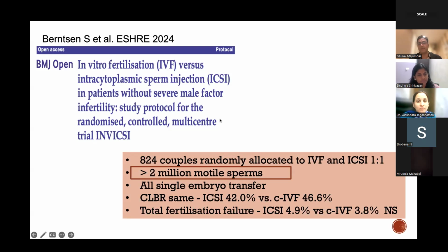And this is for short incubation IVF, sir, or is this... That depends, that's a good question. See, actually the number of sperm that we are adding is not too much, so you can do a long insemination. That's why I wanted to know, because when they add high numbers, they usually prefer just 4 hours. With high numbers, even 2 hours is enough. But high numbers don't give you the advantage that we are trying to seek.